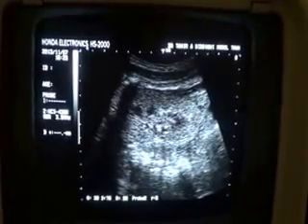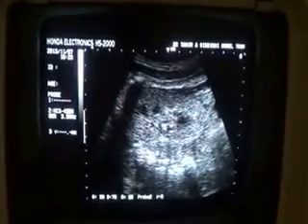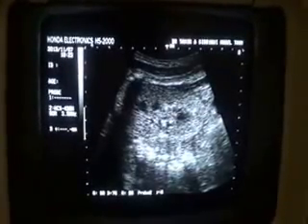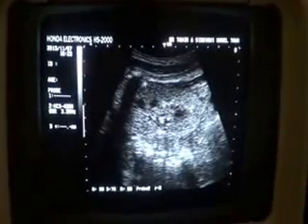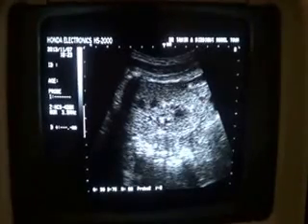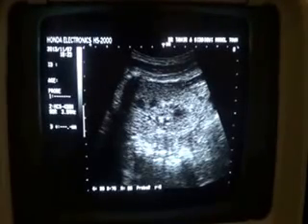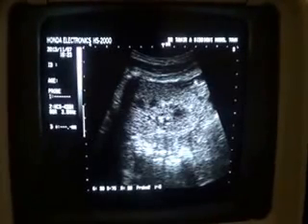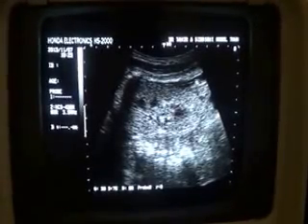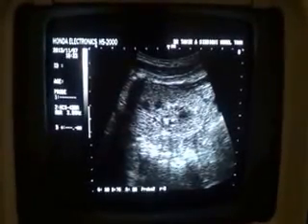These are the dilated calyces. The central sinus echo complex is totally muffled. I don't see any fat in the collecting system or the central sinus echo complex. You can see that the outer capsule is not visualized with clarity because of a small amount of fluid posterior to it. This white thin linear structure is the capsule, and below it there is fluid. This is the condition of the left kidney, giving us grade 2 renal parenchymal changes. However, no calcification and no focal lesion is seen.